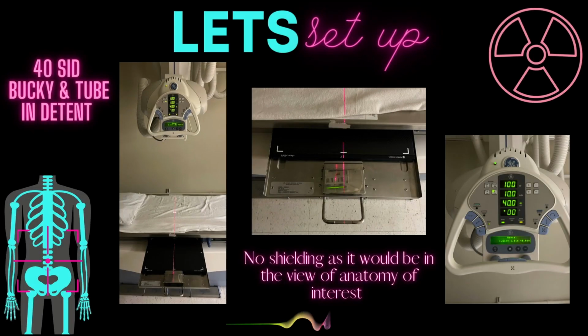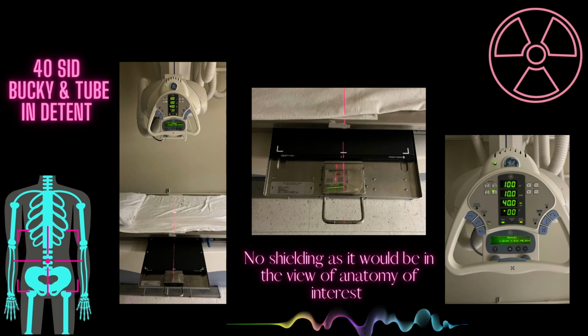While the patient is changing, we can get our room set up. For an AP supine abdomen, we will be using our table bucky tray. Our tube will be at a 40-inch SID with 0-degree angulation and will be aligned in detent with the table tray.